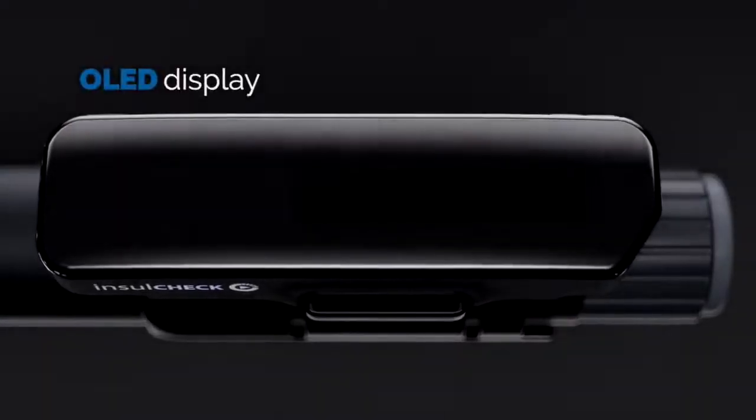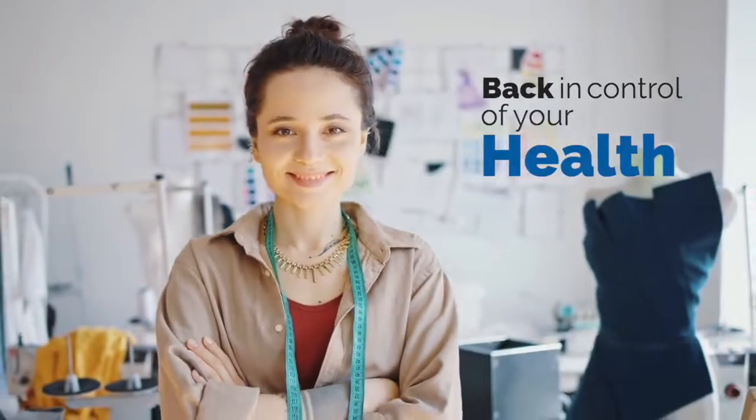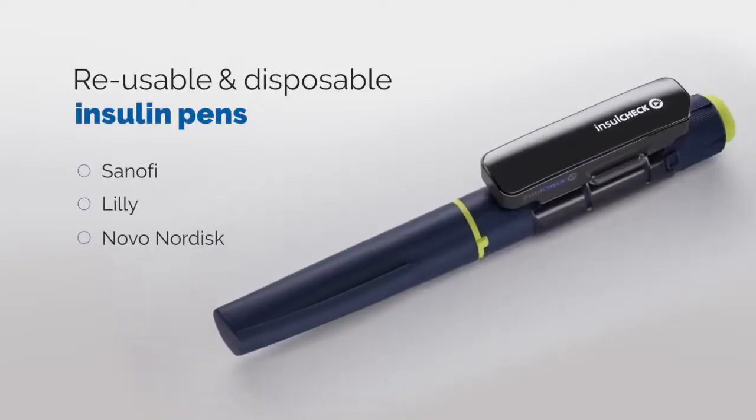A vibrant OLED display offers high-quality visual feedback during use, putting you back in control of your health. InsulCheckDose is compatible with reusable and disposable insulin pens from all major pen manufacturers.